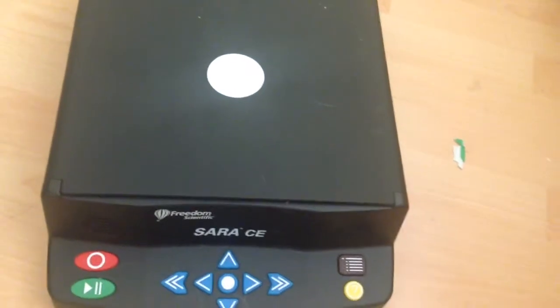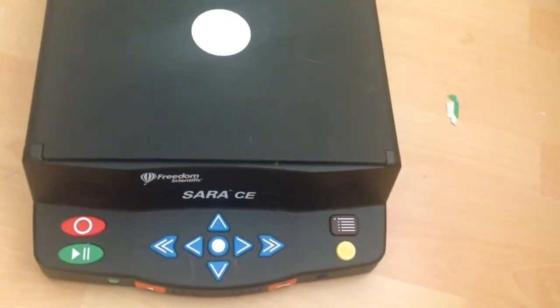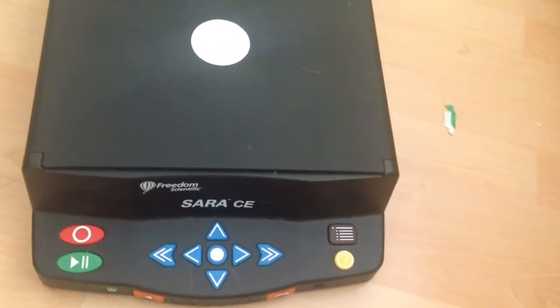Hello guys and welcome to a quick video review for YouTube. This is a strange looking device — I'm not using my normal camera because the battery is currently flat, but I want to do a quick review of this.